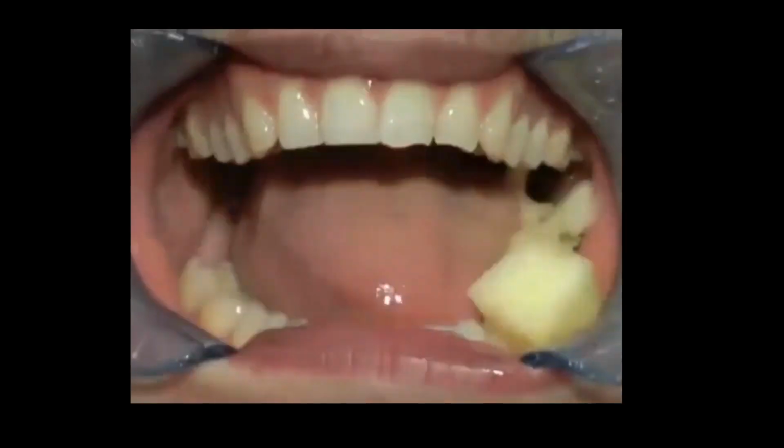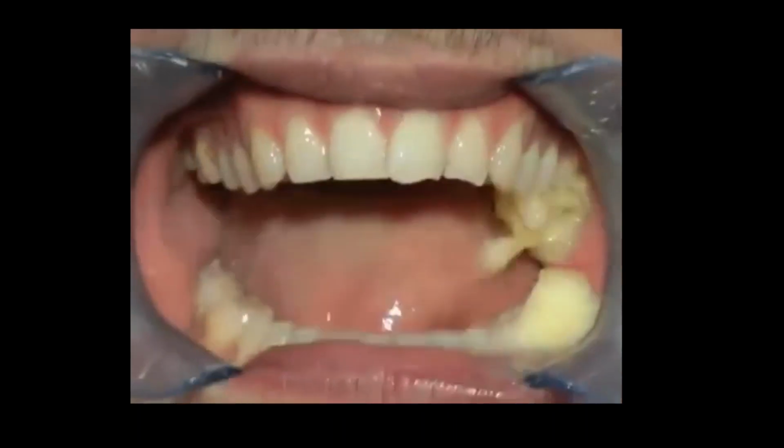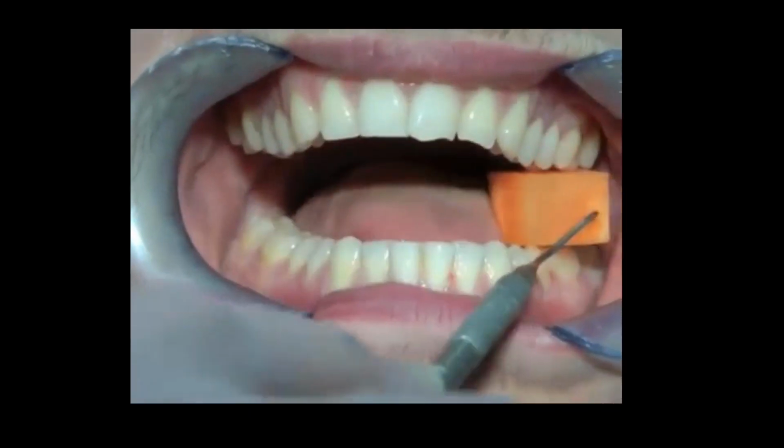So take a look at this patient, and now show me, what do you see different? Look at their chew cycle. It's more vertical based versus that horizontal angular. So now we can actually tip the teeth differently on this patient because their system works differently. They're a little bit more vertical.